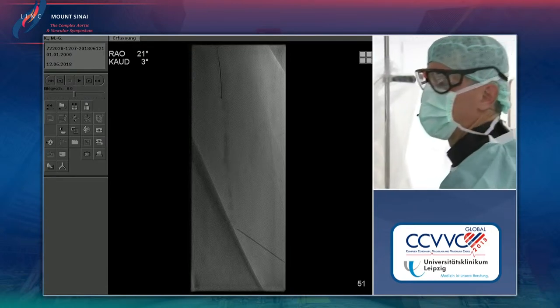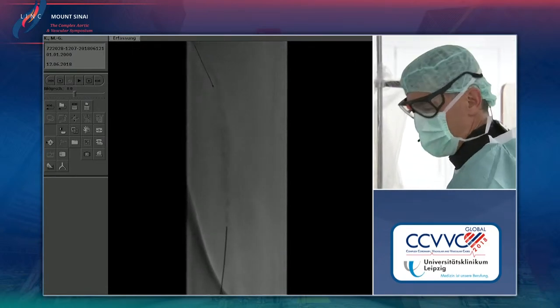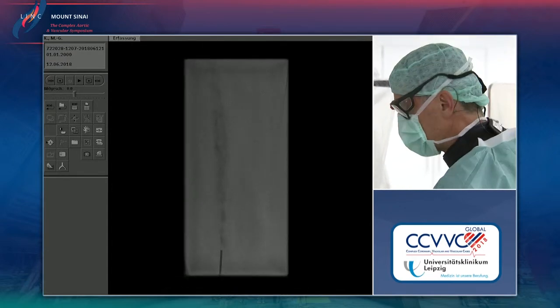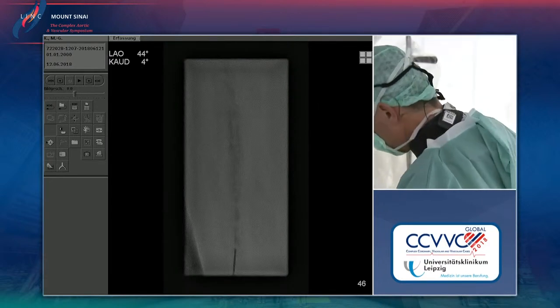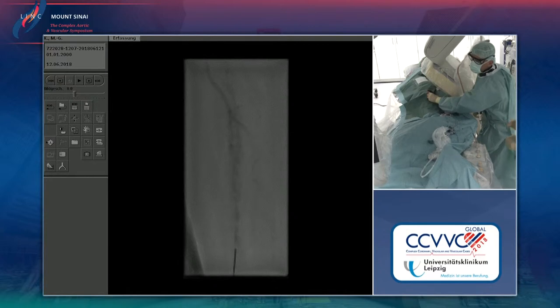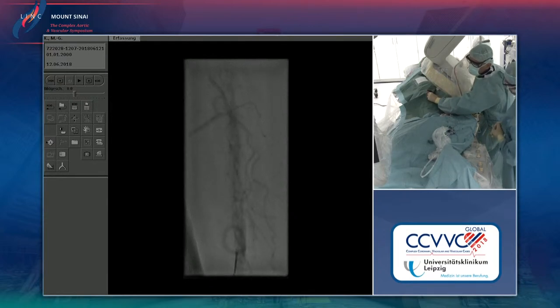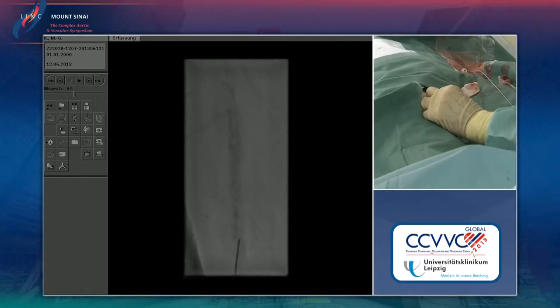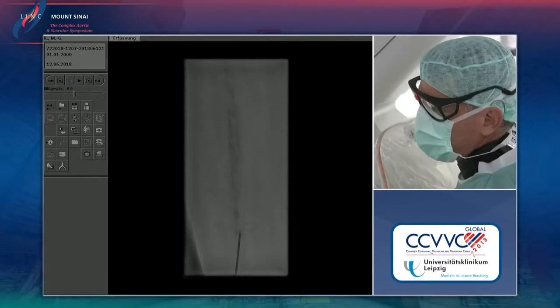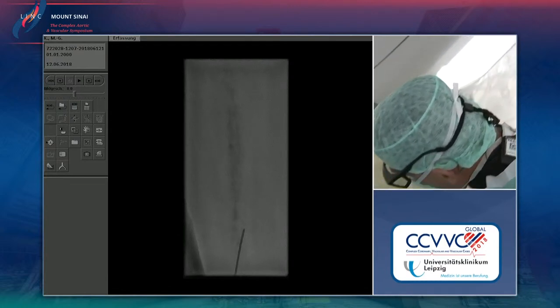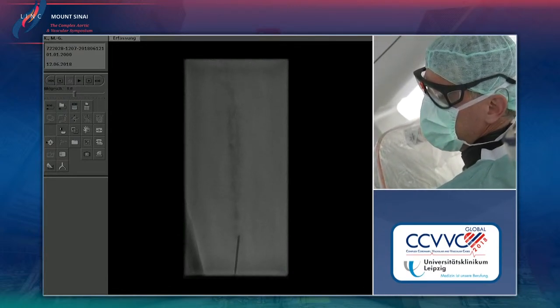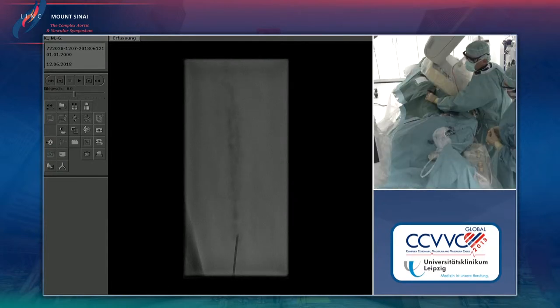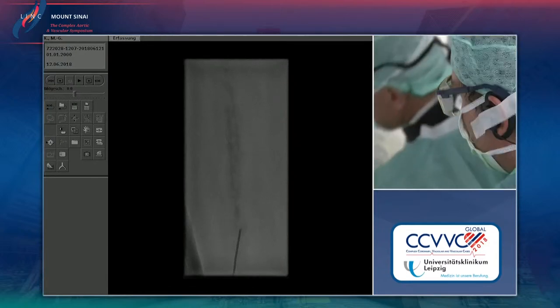We try again as has already been attempted — the calcium really leads us here. We give a little injection. The calcium is really strong here. Now the needle jumped away from the calcium, it's very calcified. I try to twist the needle a little bit inside. We are just trying to reach the calcium.